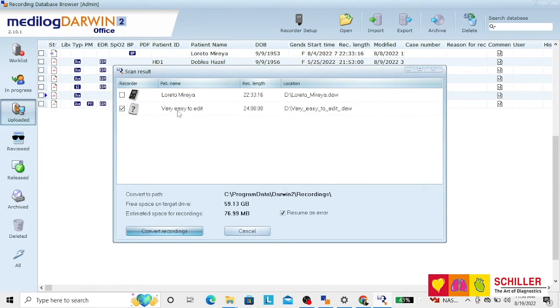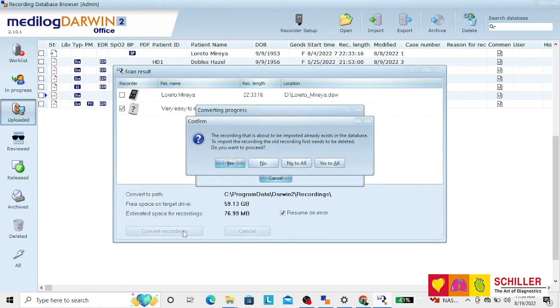select the recording, you should only have one, and click on Convert Recordings.